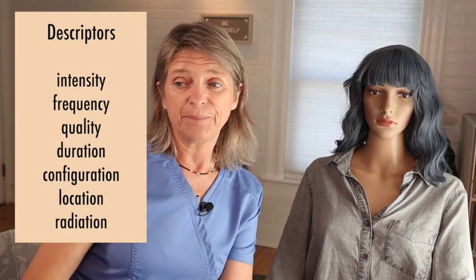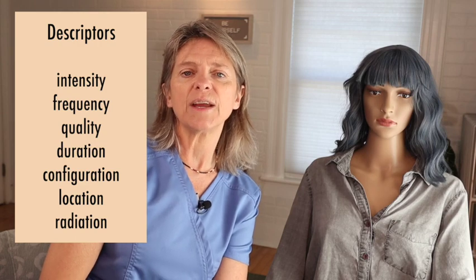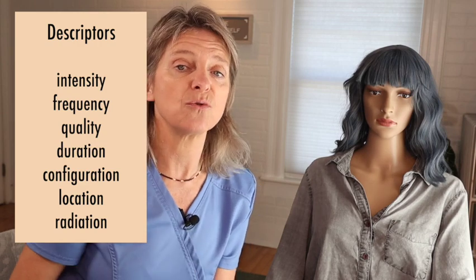I hope you're not. So we're going to be doing the descriptors, and the descriptors are going to be listed here. You can see them and look at those yourself, but basically you want to understand what the descriptors are, because that's how you're going to document it.